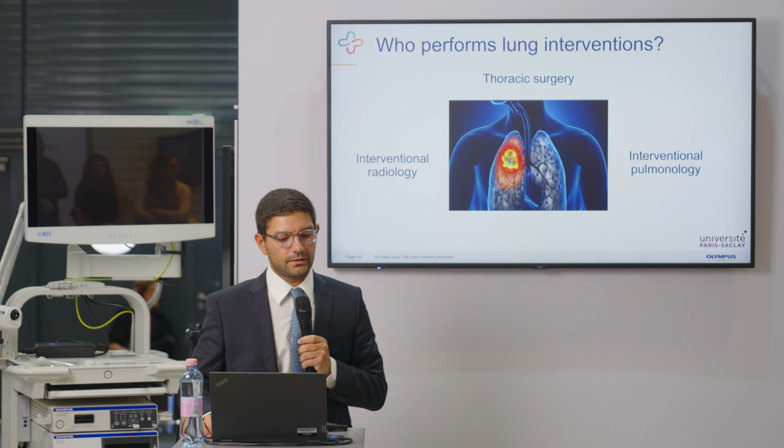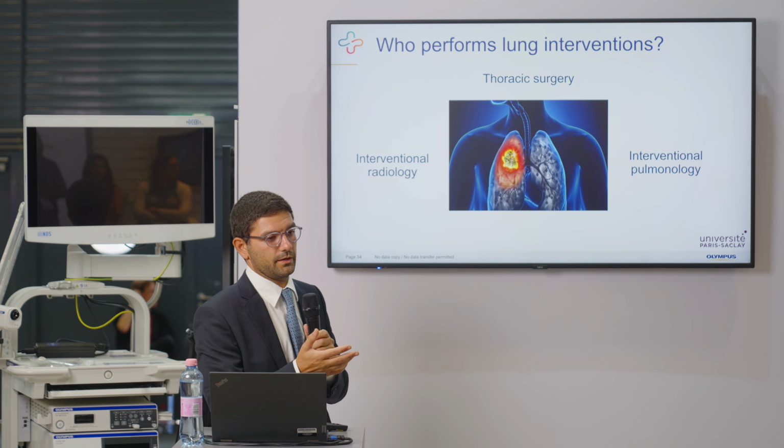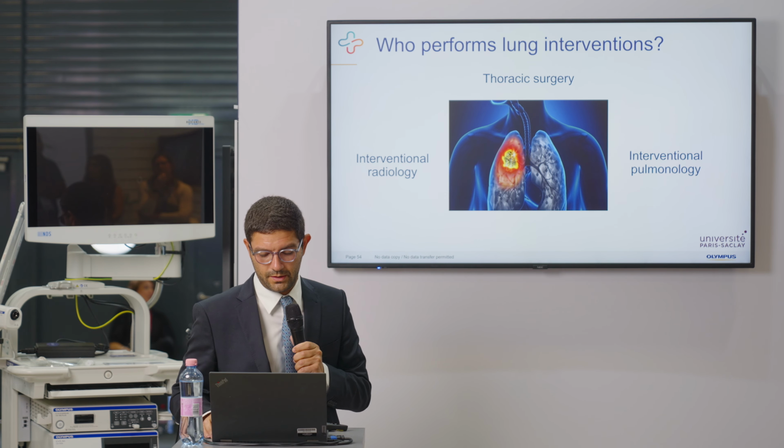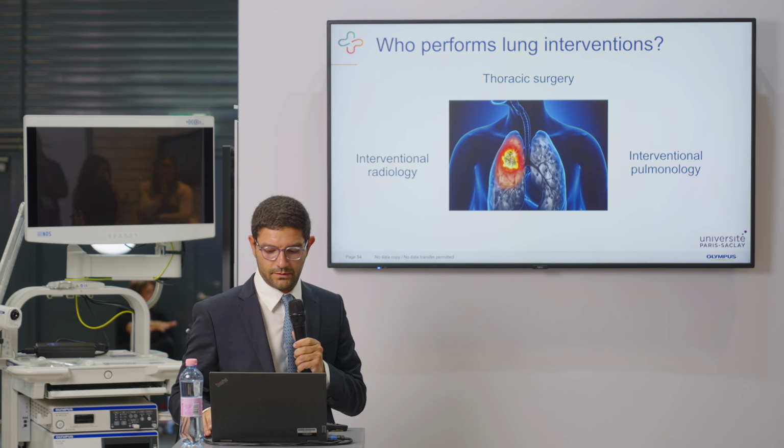The second technique is the CT-guided biopsy, but there is more risk of pneumothorax, bleeding, and pulmonary air embolism. And third, the interventional pulmonologists, with the technology that I have shown you.